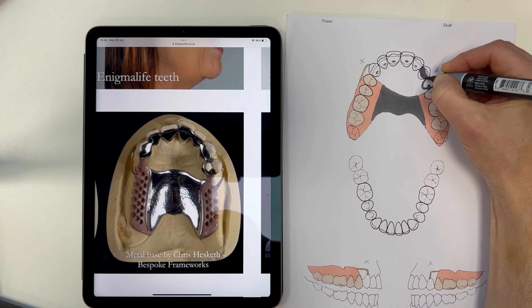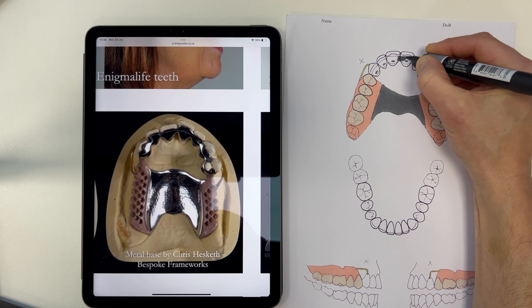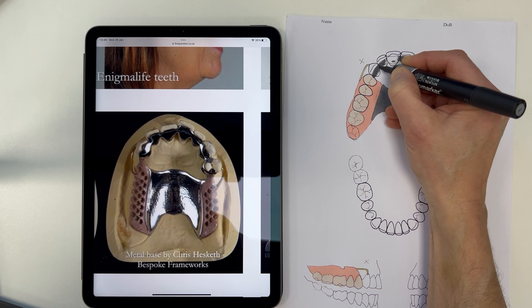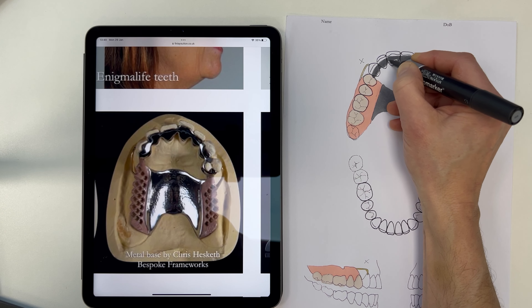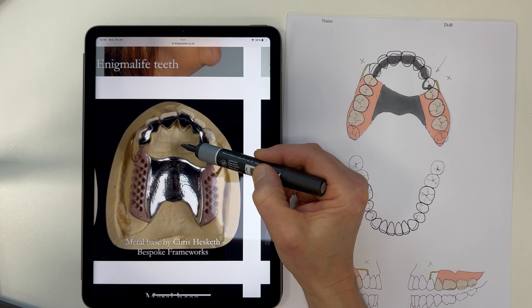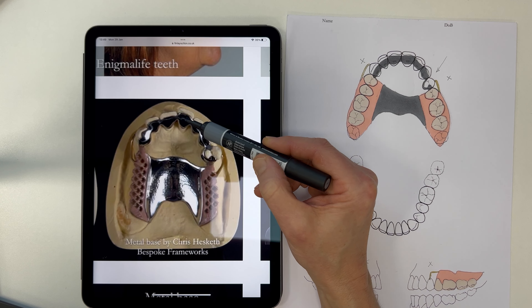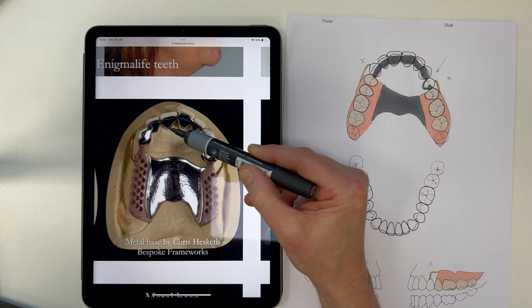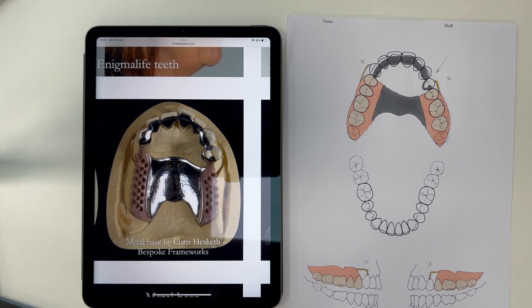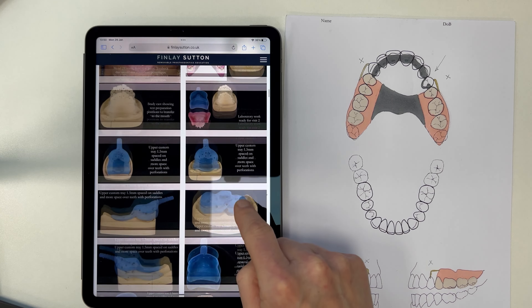Let's link all of these up — these are like resin bonded bridges. The most important thing is to keep the gingiva clear in this direction from the palate and from the lingual direction. The coverage of the tooth is absolutely fine — it can creep almost to the edge just like a resin bonded bridge if need be, but it's really important this area is kept nice and clear too.